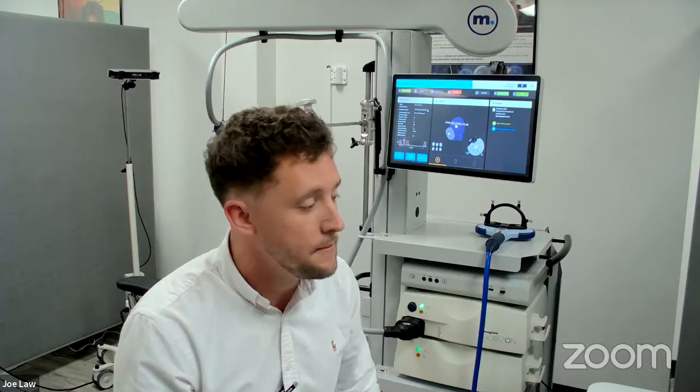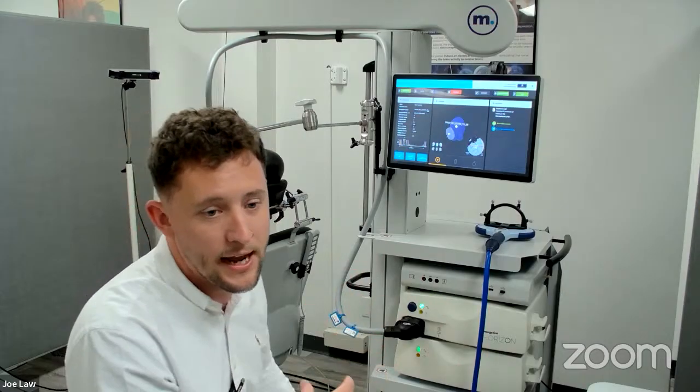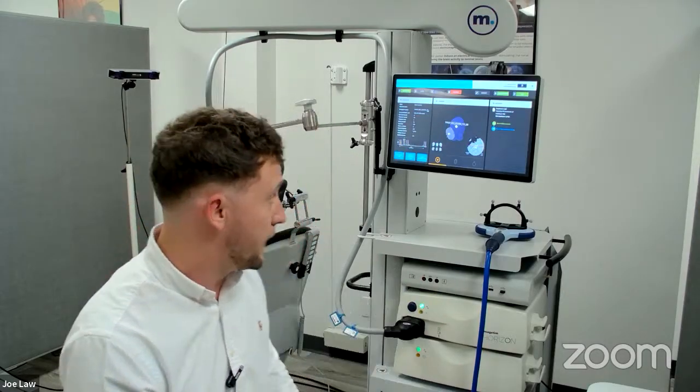Let's attempt to deliver those 240 again. Admittedly, it's a one-time per treatment thing. You can't keep trying over and over again. You have one chance at the end to deliver any missed pulses. So that would be the full workflow.